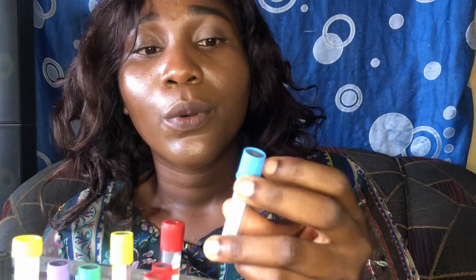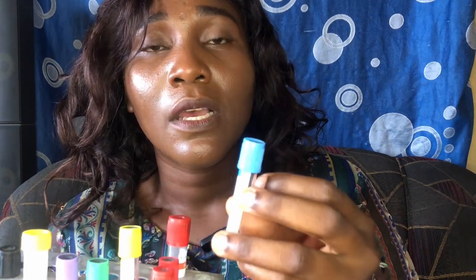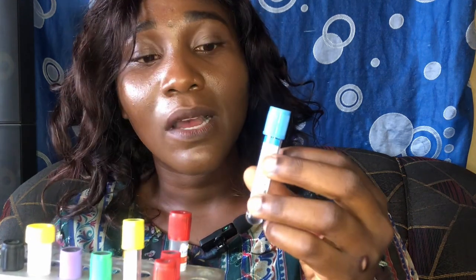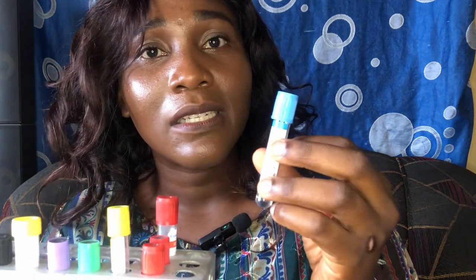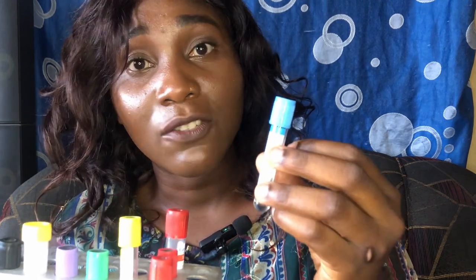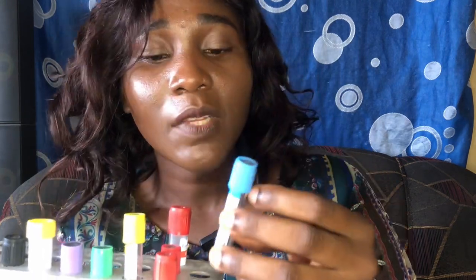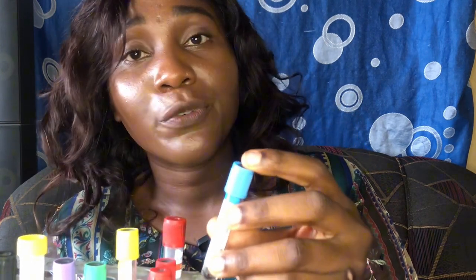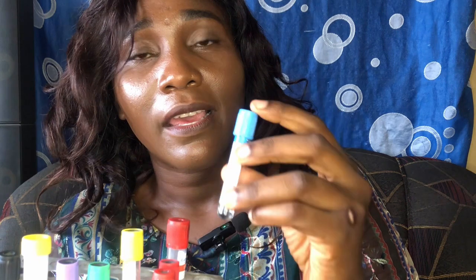If you check, there's a defined ratio of anticoagulant in it. The anticoagulant in here is sodium citrate, and there is a required amount of blood. This anticoagulant helps to prevent clotting in this tube.